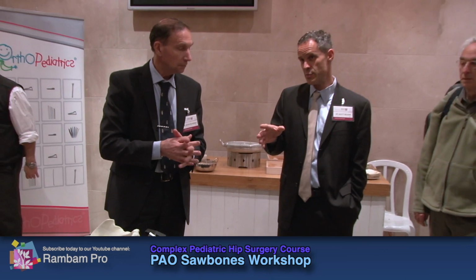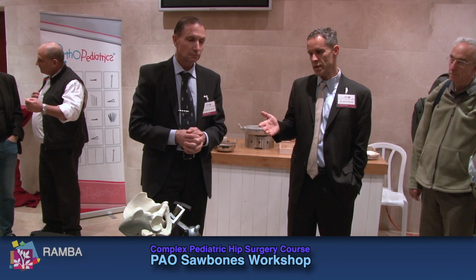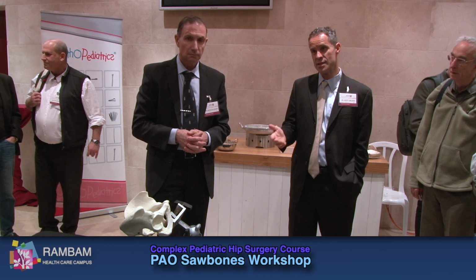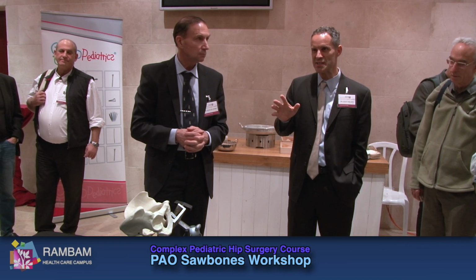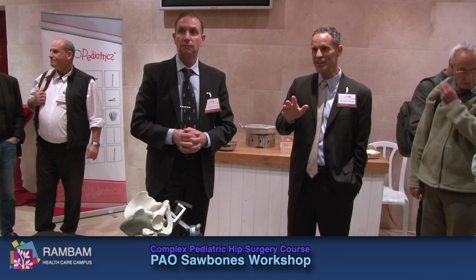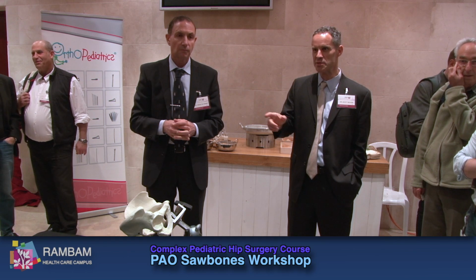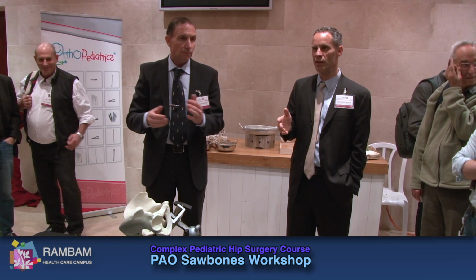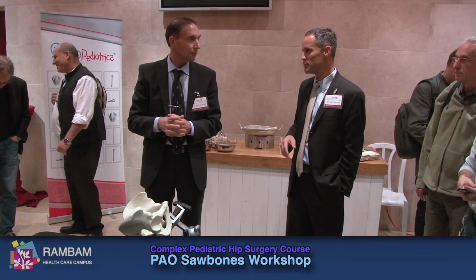That depends on the size of the patient as far as if you're talking about the incision. If the patient is larger, doing the more traditional Smith-Peterson is helpful. And I think also starting out, doing a bigger approach is excusable, and you're not going to cause any problems by doing that. In fact, you're less likely to cause problems if you have a bigger incision in this type of surgery. So it's difficult, and don't try to be minimizing your incision on the first few times you do it.